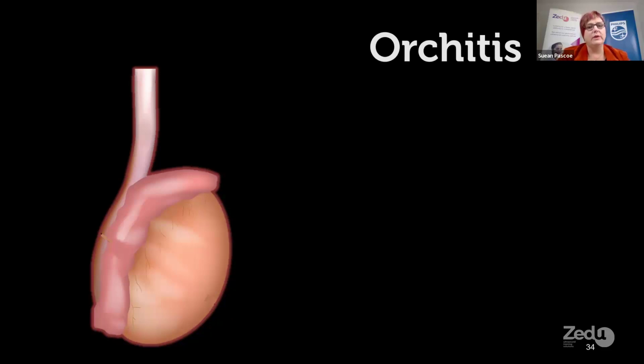And it's for that exact reason, I've been looking, obviously, in preparation for tonight, I've just been reading a few of the papers, and there's a lot that talk about using RI values and stuff. I absolutely do not think that this is the place of a point of care scan. First of all, to get RI values and to get pulsed wave Doppler traces on such a small vessel requires really, really good probe skills. And so there's only a handful of people in the country who have enough skill to be able to do that, but then also know how to optimize the pulse wave Doppler trace as well.